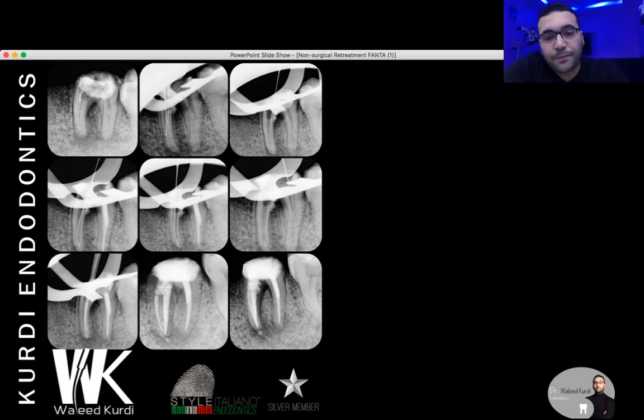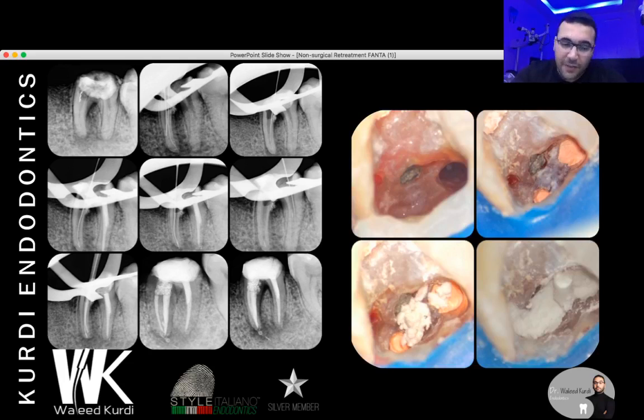And then I told her, okay, let's give it a chance. You can see here in the mesio root, we have this perforation, and here is the mesiobuccal and mesiolingual, and you can see another perforation where the file was. I don't know why he broke a file in this part, and it was not in the canals, but anyhow, we all do this.